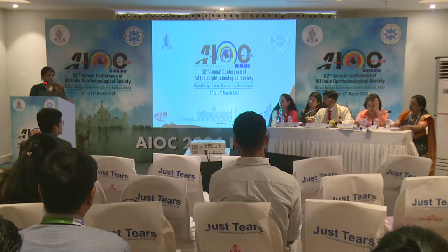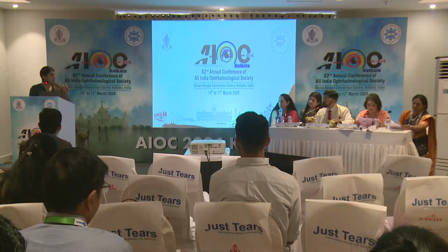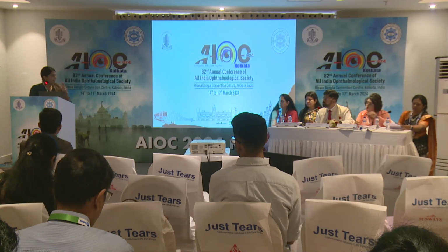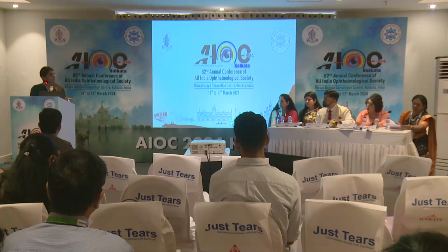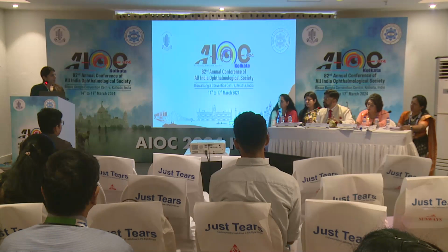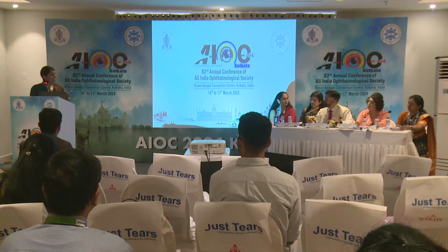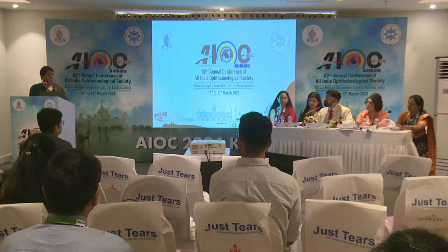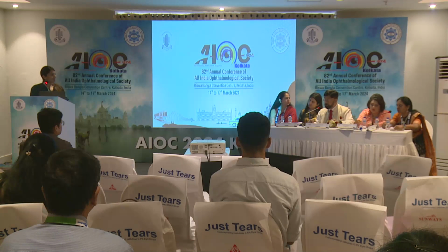One thing is Argos uses a segmental refractive index. So in the anterior chamber, because it is measured through the aqueous, it uses a different refractive index versus what is used for the vitreous, whereas IOL Master 700 just uses one refractive index value to measure. So it could be because of that. The IOL power calculation should have been the same, but there is a difference. The difference in the IOL power was not clinically significant. So ultimately there may not be a clinical significance, but because our sample size is small, that serves as a disadvantage to come to any proper conclusion. So this serves more as a pilot study.